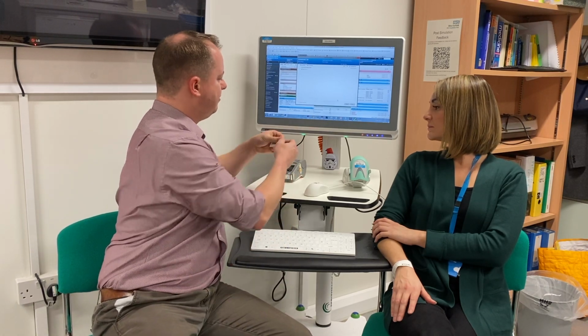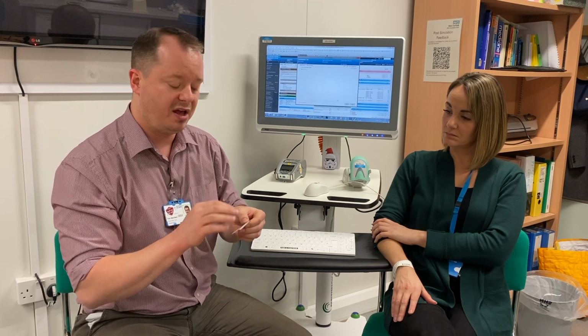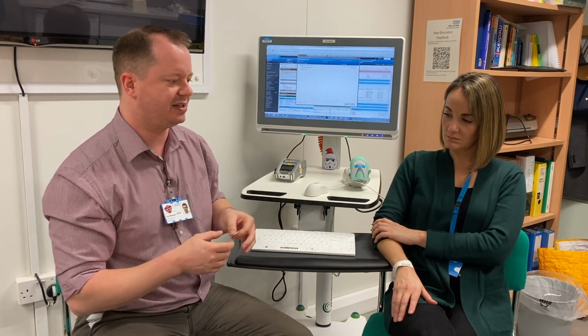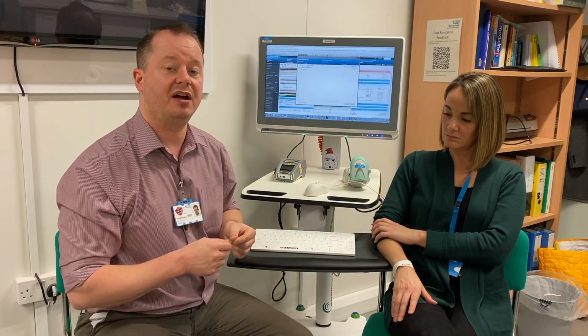Once I have my label, I could then peel it off and stick it to my blood sample, making sure that it is the correct label that I've got here. And then once those are all labelled, we can thank the patient, leave the area tidy, make sure they've got everything they need, their table, their drink of water, and then we can go and send our samples to the lab.